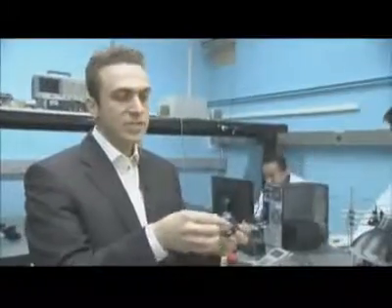"So this is the cell phone, okay? And I'll open its case here. Cell phones are everywhere. Even in Africa, almost 20% of the population uses cell phones actively. And we can actually capture that image with just a cell phone as you use it and wirelessly transmit that to a PC station. The results will then be sent back as a text message." A text message that could save lives.